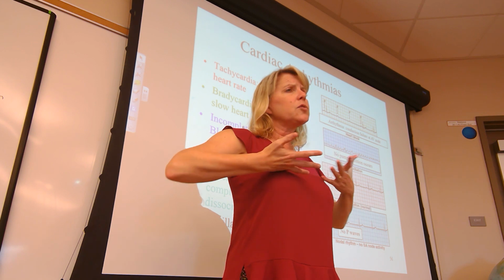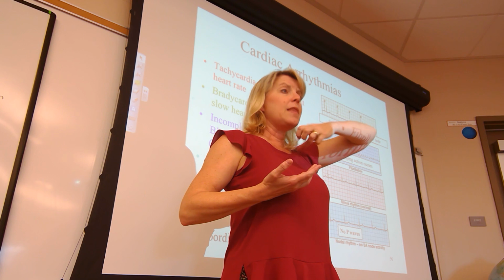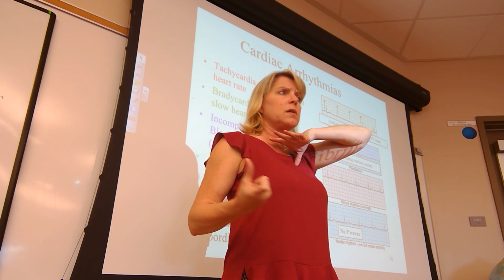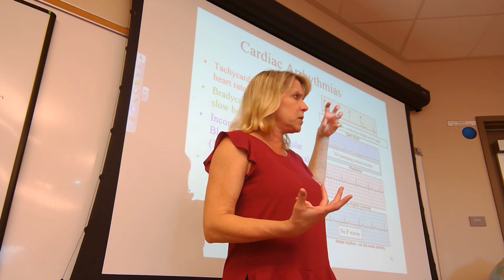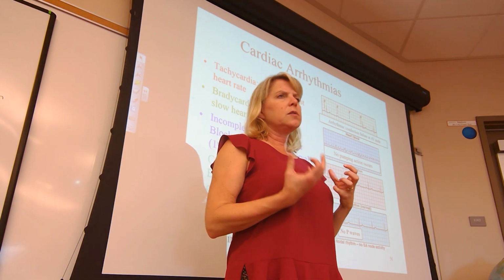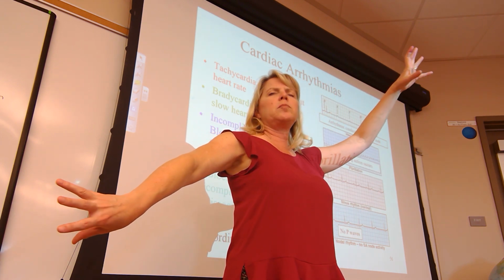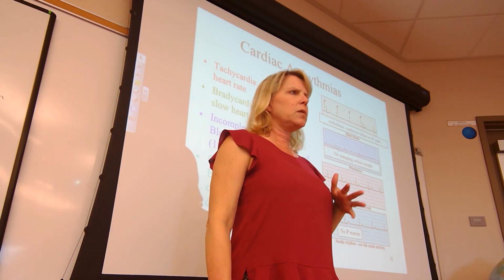So if there's a blockage, then the atria will reach threshold and then have their mechanical events on their own, and the ventricles will be left to their own devices. We will have total dissociation of atria and ventricles. That's third degree AV nodal block. Dissociation of P waves from QRSTs. The atria and ventricles are no longer communicating. The atria have no influence on the ventricles.